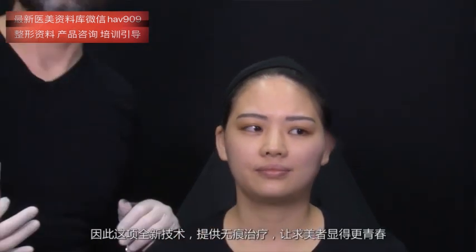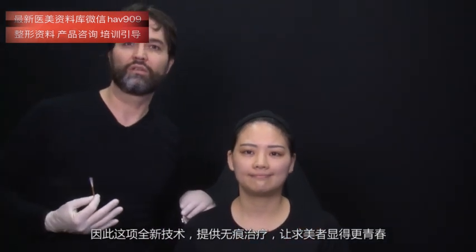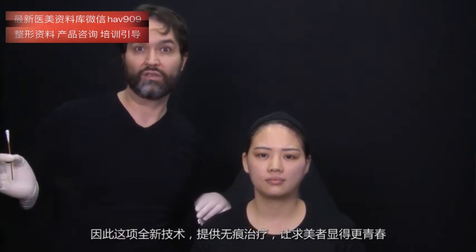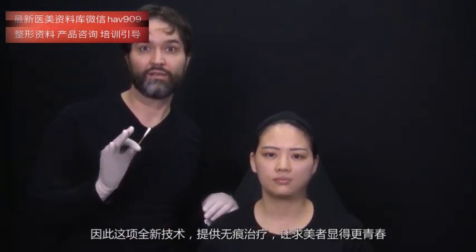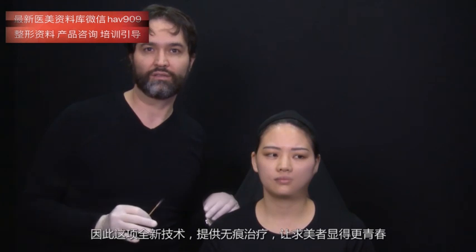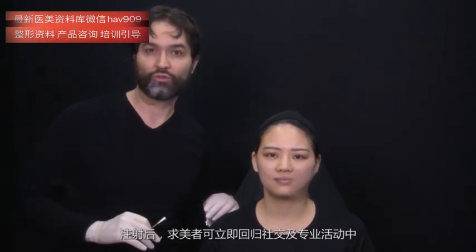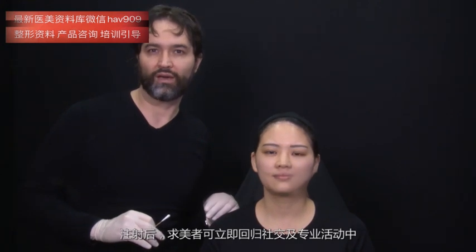So this is the new technology, giving a treatment, making the patient look younger and with no presence of treatment. She can go immediately to her social and professional activities.